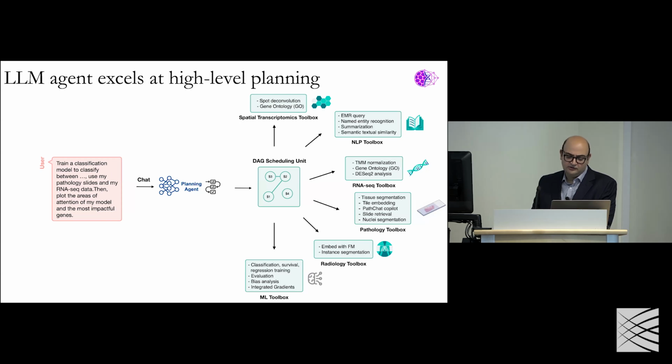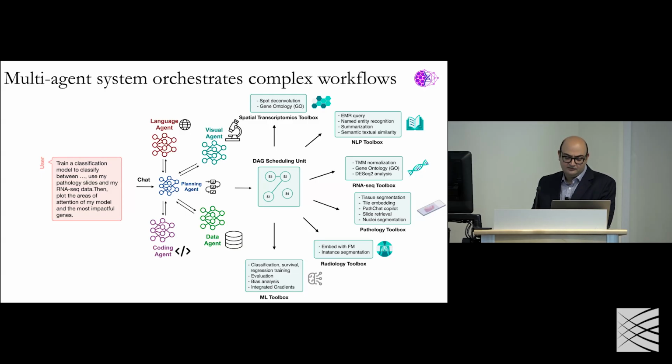So we started building this agent. Initially, it was just an effort centered around pathology, and as the studies were going through the review process, we had requests: can we add other kinds of tissue analysis besides just looking at pathology images? Can we look at spatial transcriptomics? Can we look at radiology and other kinds of data? So that's what we have effectively focused on.